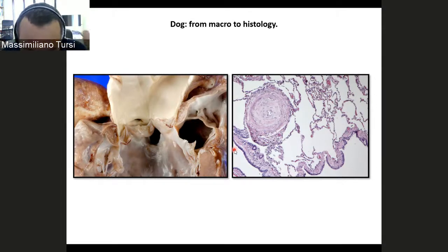Because in both situations, we may have pressure overload or a volume overload, or both. And this kind of alteration induces mechanical remodeling, chronically speaking. And so we are also at the moment of the stage also of necrosis, sure.